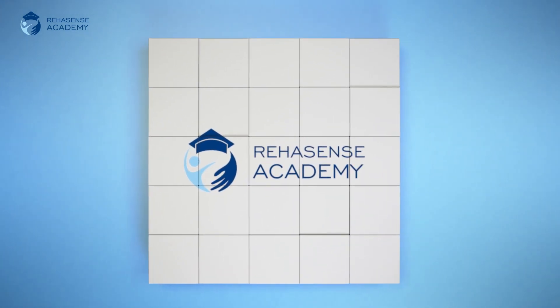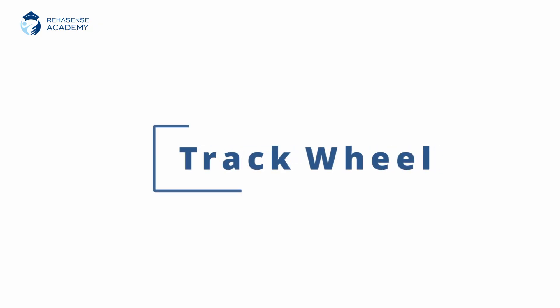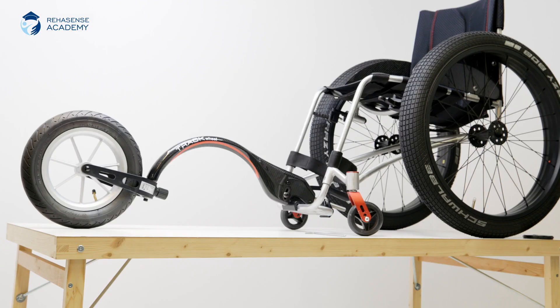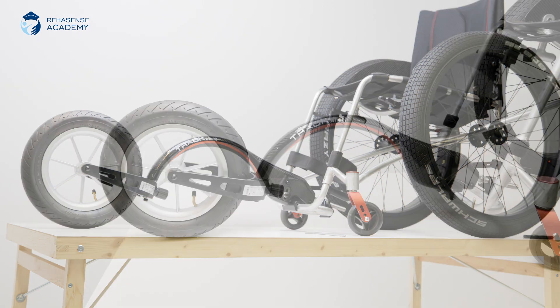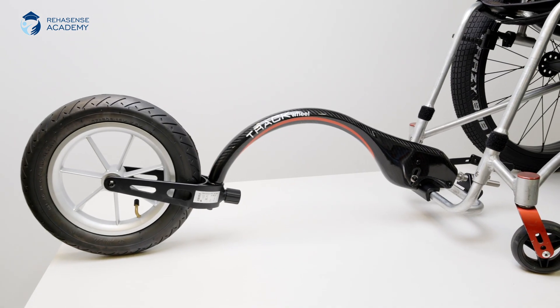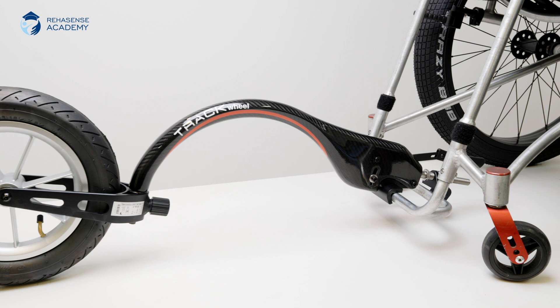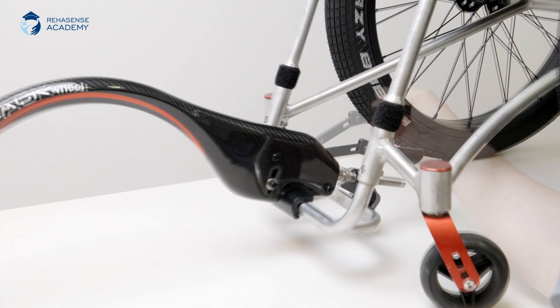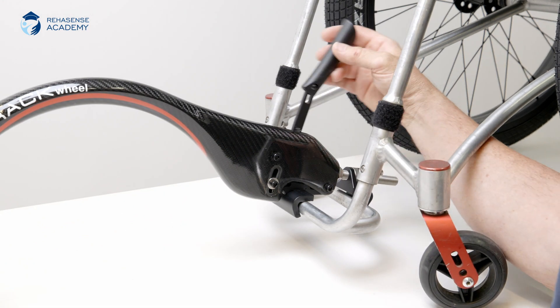Welcome to RiaSense Academy. Today we will adjust and mount the track wheel onto a manual wheelchair and transform it into a tricycle. The starting position is with the track wheel pointing forwards as shown. Please note that you need a wheelchair with a rigid footrest. The lever handle is used to lock and unlock the track wheel.